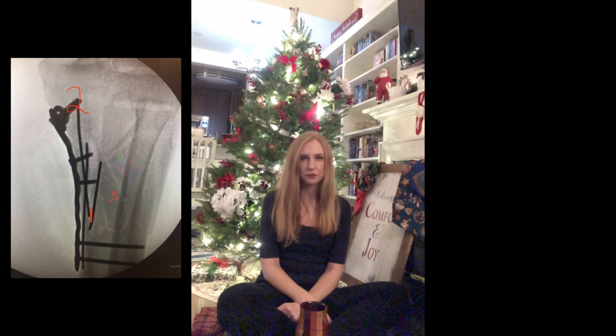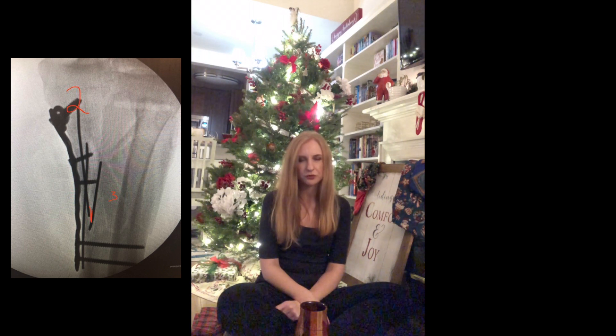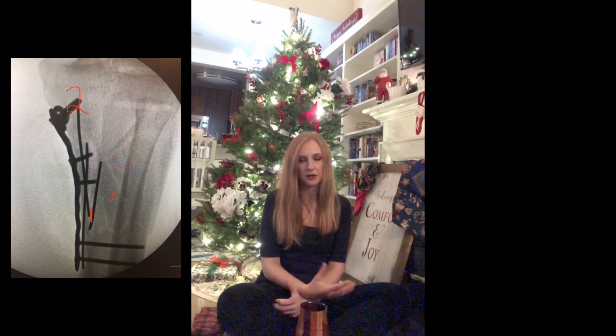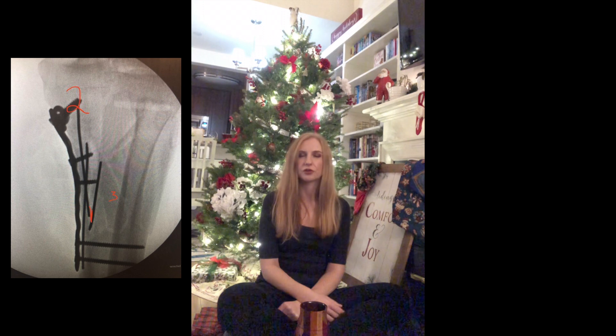I planned an indirect reduction of fragment X and to bridge it if necessary. Even with a good surgical plan, you have to be prepared to change it according to circumstances. In this case, fragments 1 and 2 were reduced as planned. You see here my posteromedial plate with very short screws. I do this routinely to avoid getting into the lateral fragments — if they're still unreduced and you put screws into them, they'll be impossible to reduce later. So I do this temporary buttressing fixation so I can return later and make my screws longer if needed.